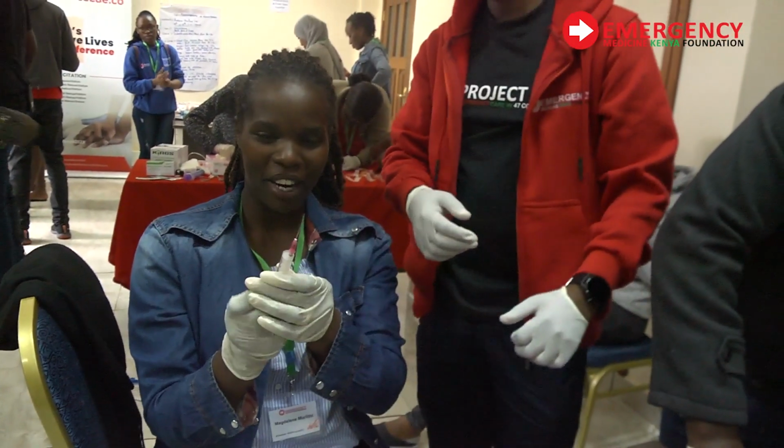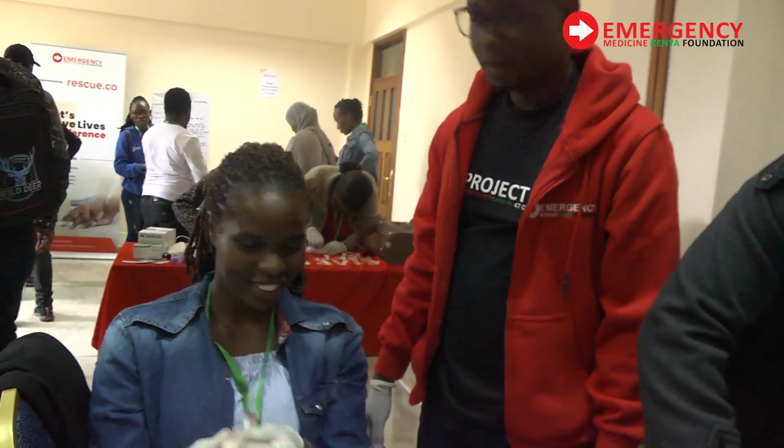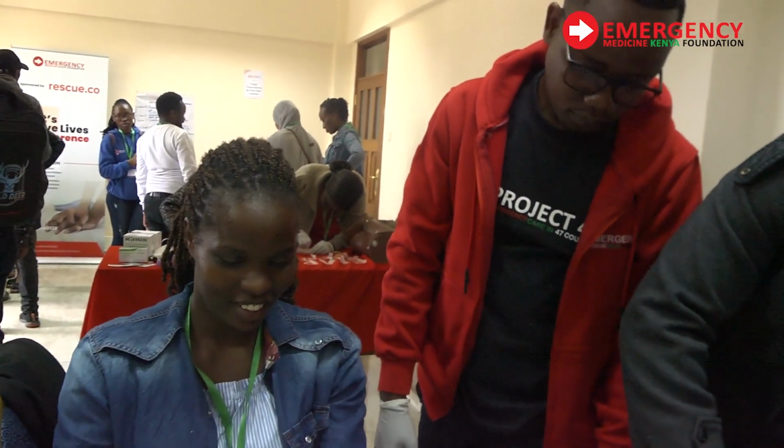I've never seen that. In fact, these guys haven't told me about this. I just know about this one, because this is what we have been doing commonly for children.